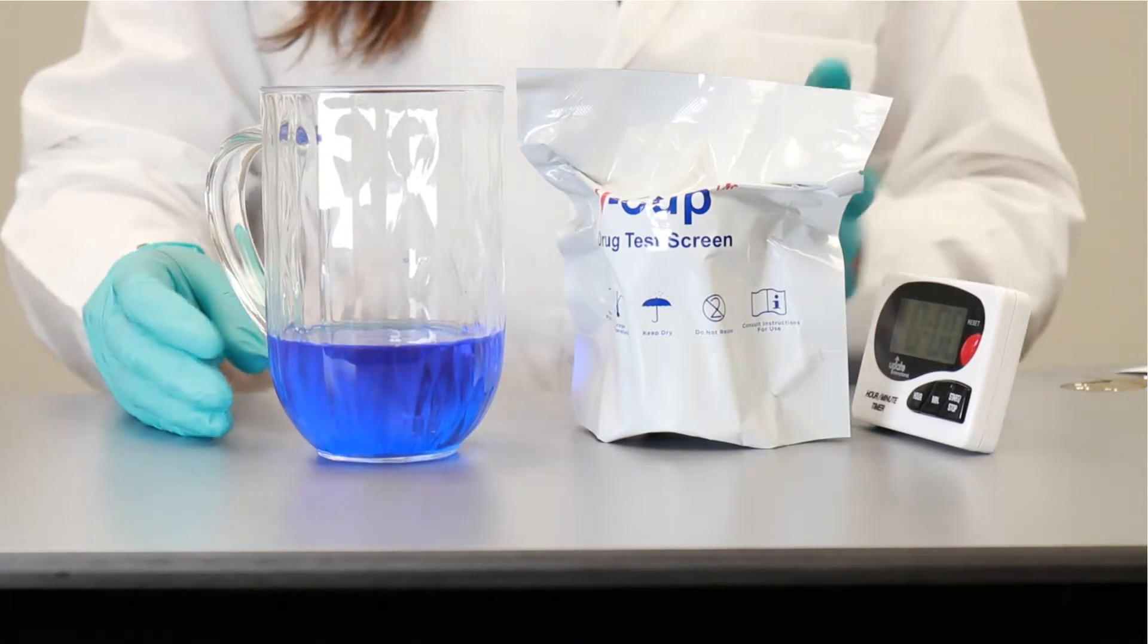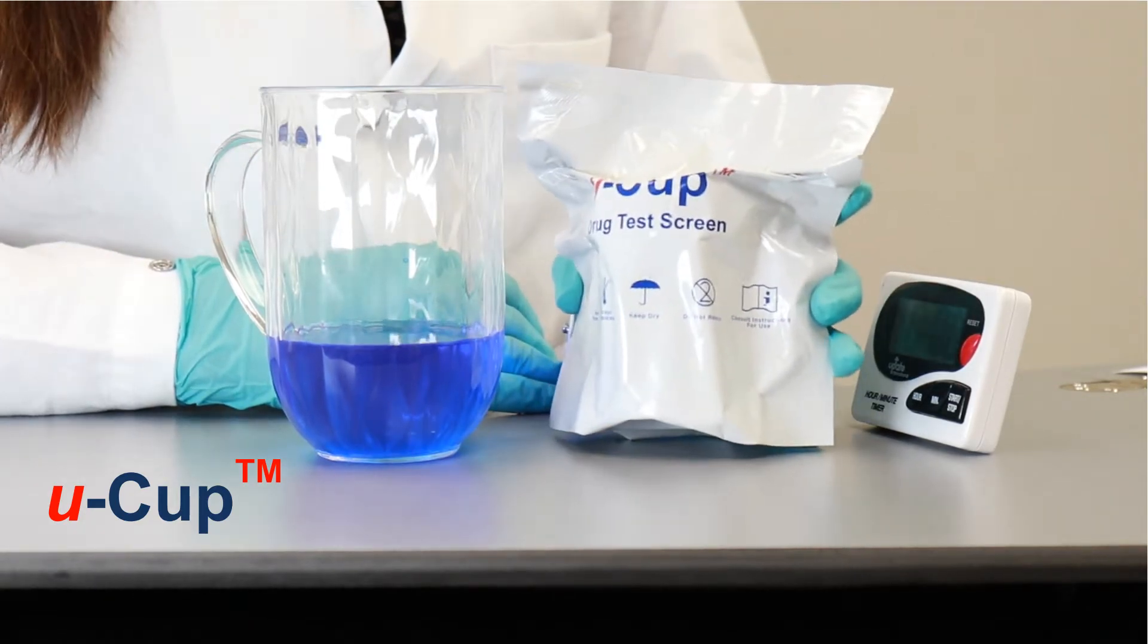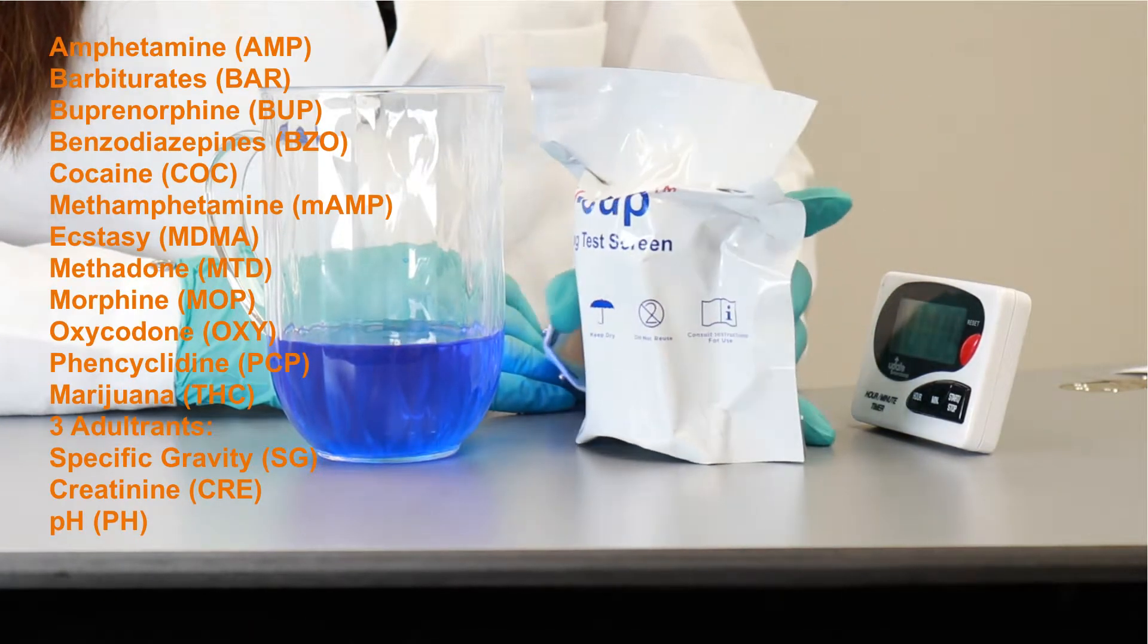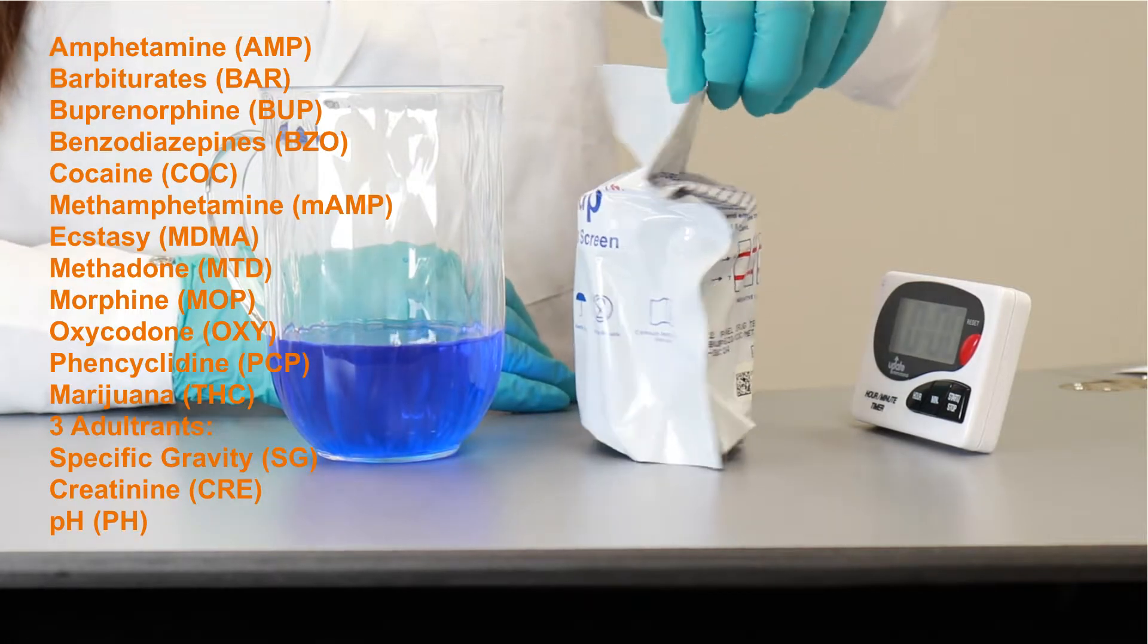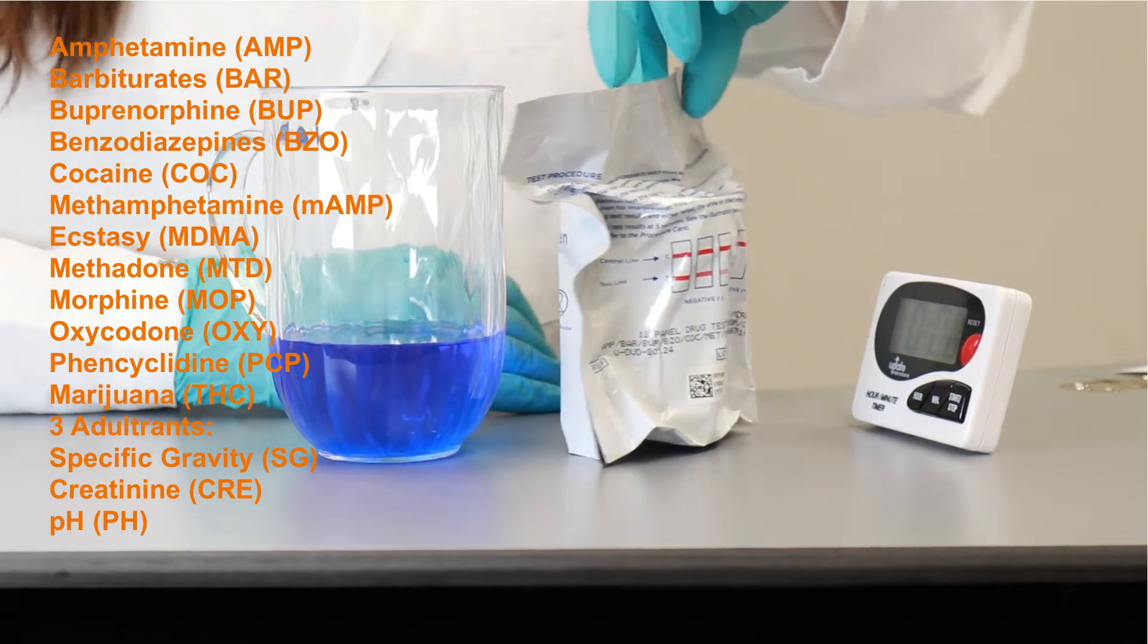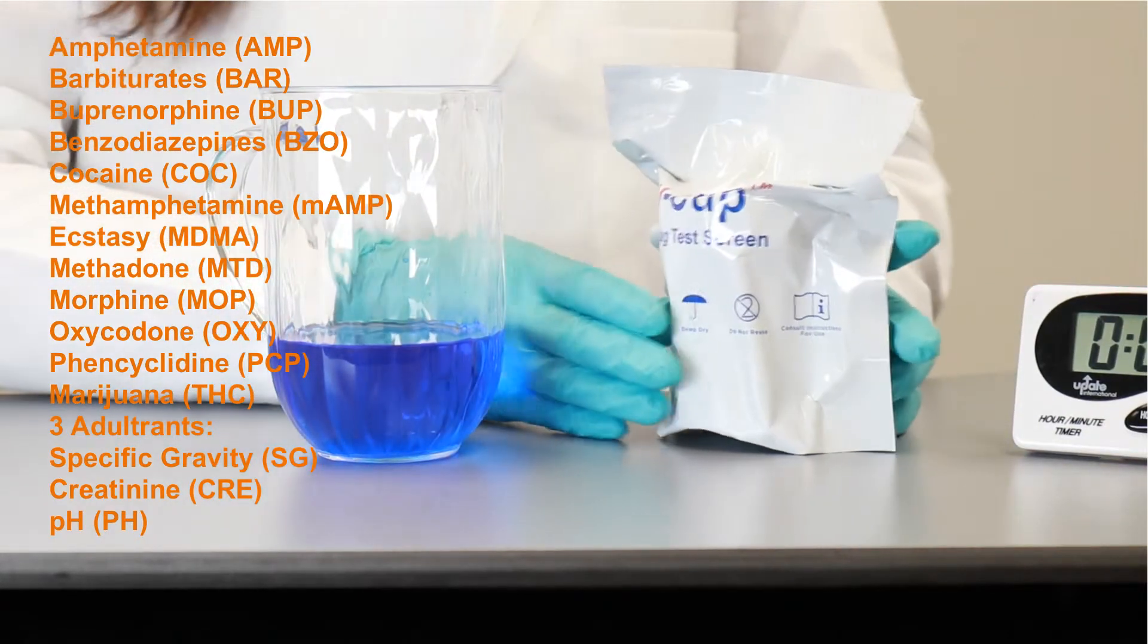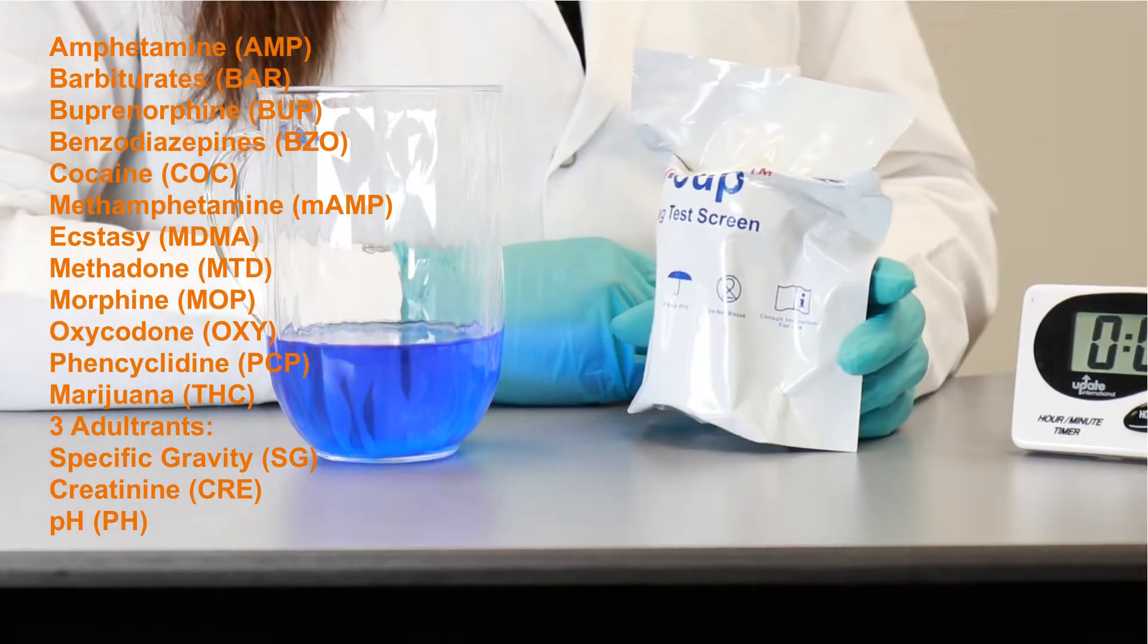We have these U-cups that we are going to be showing today. This particular one is a 12-panel cup with three adulterants in it. These cups are FDA approved and CLIA-waived, and they come in up to 16 CLIA-waived drug configurations.